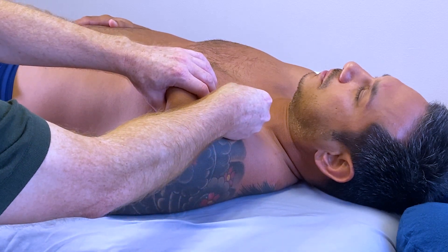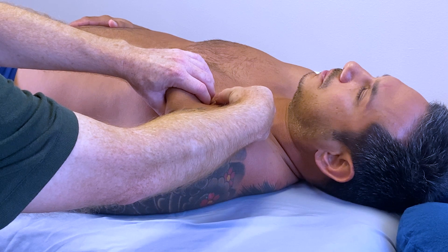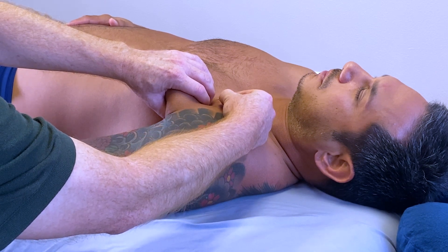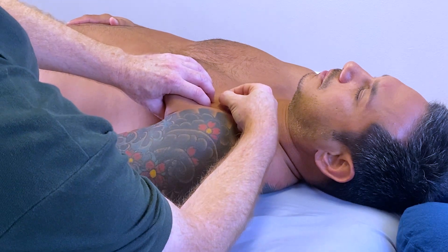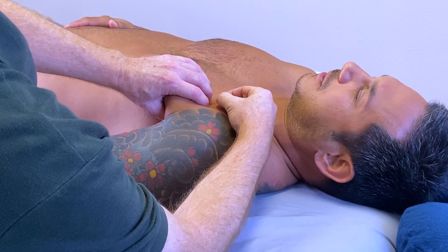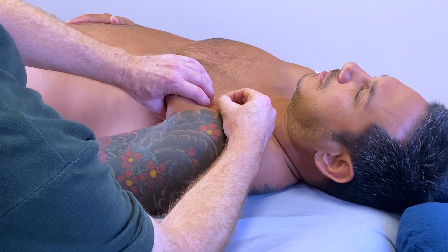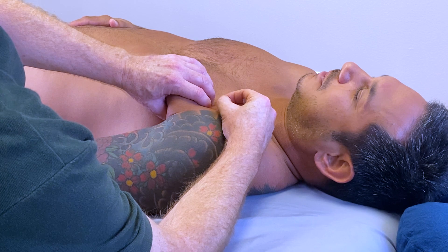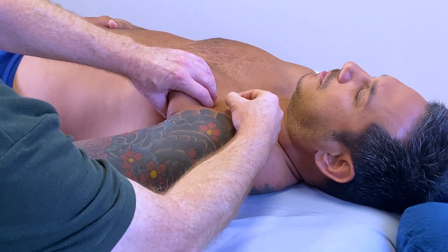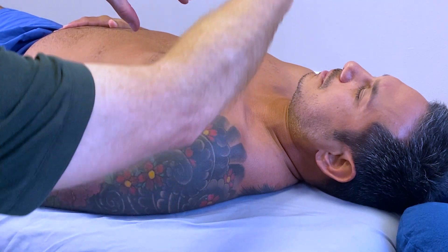Place the guide tube at an angle that allows the needle to penetrate the band, then advance the needle into the pec major, directed towards your thumb and with the needle parallel to the ribcage. You can redirect the needle, but keep it parallel to the ribcage until you get the needle response. The needle should always be directed parallel to the ribcage — never aim the needle towards the ribcage or downward towards the pleural cavity.